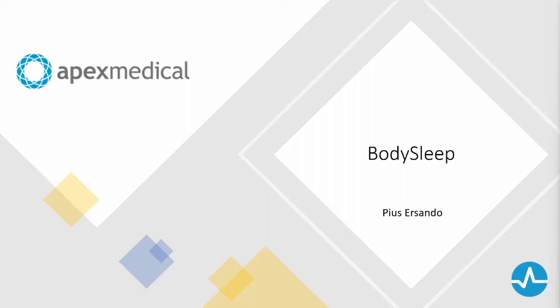Welcome to our webinar. This will be the first in a series of webinars about the Nox Sleep Diagnostic Equipment and Software. Today's webinar is on BodySleep. For those of you that are using a T3S or A1 device, this may be a good refresher on what BodySleep is and how it works. And for those of you that aren't familiar with BodySleep, I hope you find this presentation interesting and informative. So, let's get started.